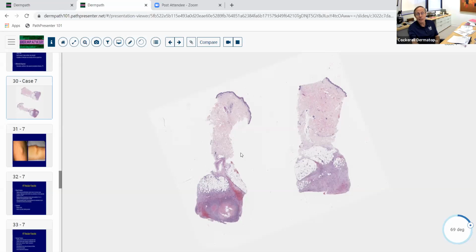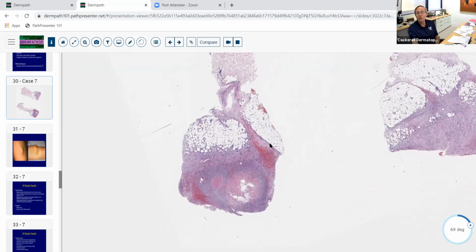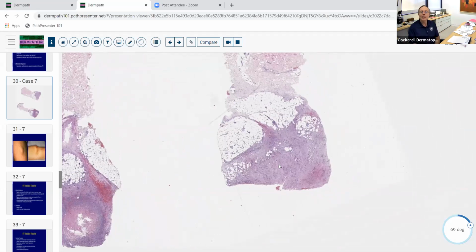So this guy may have done a punch. If he did, he got really deep, because this pathology is below the level of the subcutis. So what lives below the subcutis? Well, the fascia. If you get a biopsy of the fascia in dermatology, the good news is there are really very few diseases you have to think about. Is it a neoplasm involving the fascia? Is it a sarcoma? Is it like DFSP that's dissected underneath the fascia? Well, maybe. But if it's a nodular lesion involving the fascia, you really only think of a few things: maybe an infection, maybe some weird ruptured cyst, but the most common thing is nodular fasciitis.